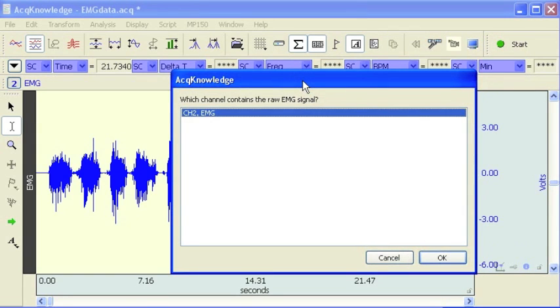This particular analysis routine is going to give you the Integrated EMG, and that is defined as the area under the curve of the rectified EMG signal. That is the mathematical integral of the absolute value of the raw EMG.